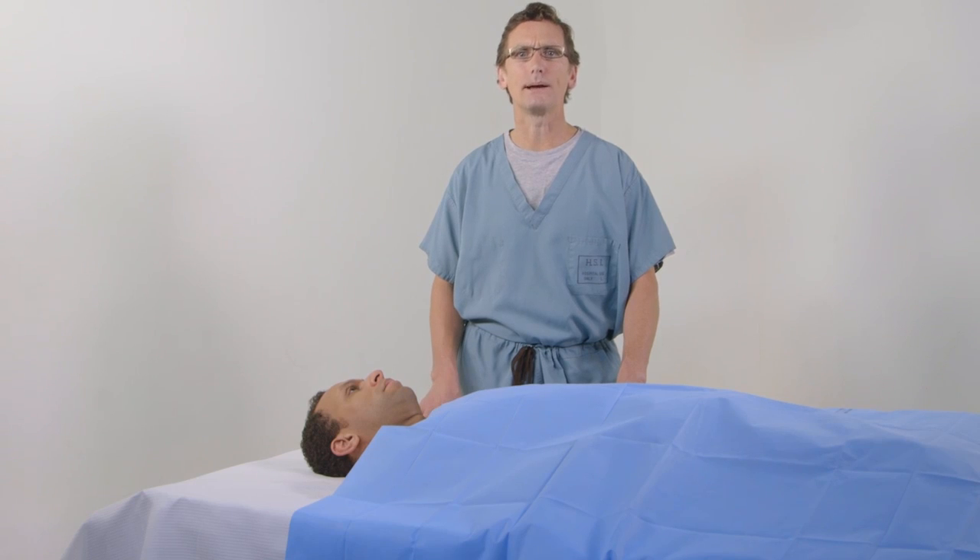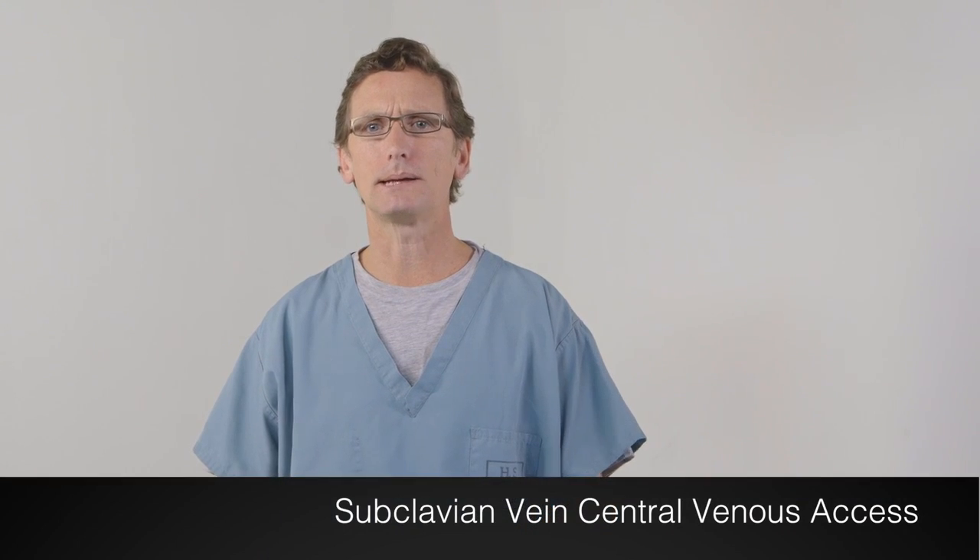I hope you will find them helpful. One of the primary benefits of the AxoTrack device is that it enables the performance of an ultrasound-guided subclavian central line placement. Here, I will show you how I perform this procedure.